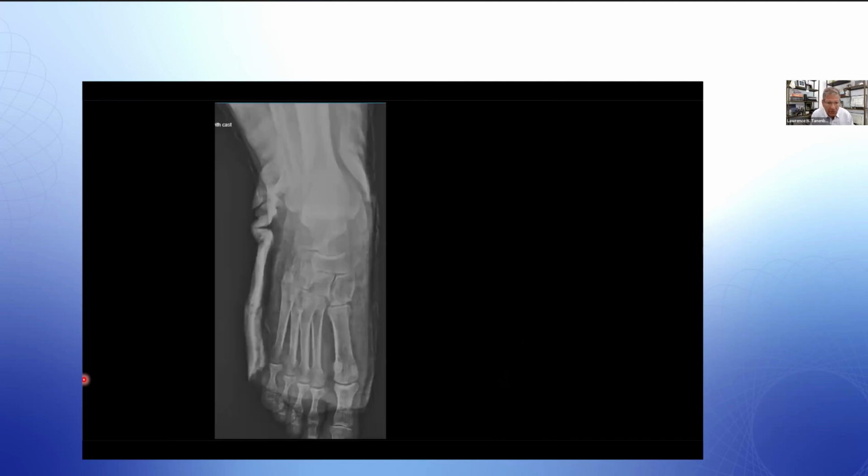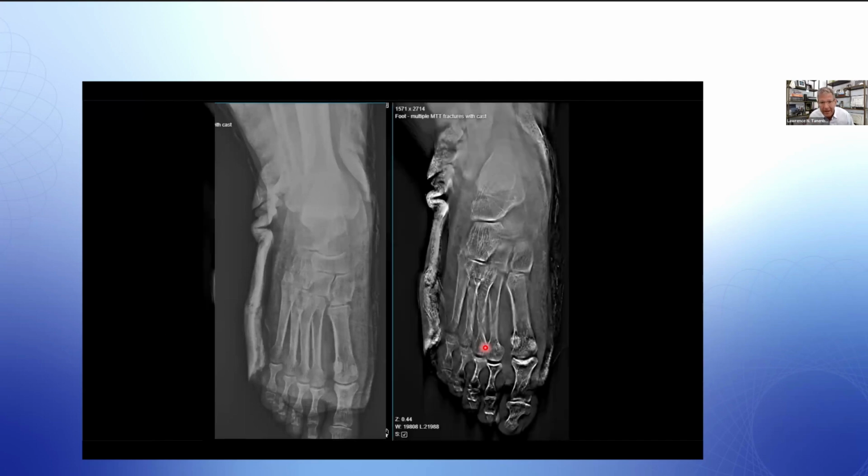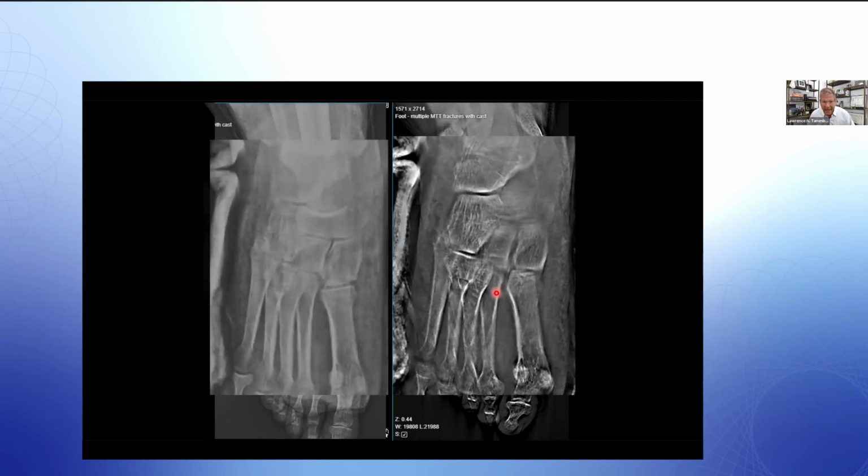Here you see a patient, again, who's in a splint of a sort, suspected fracture of the foot. I can't see much of anything on the full volume X-ray exam, but when we look at these tomosynthetic slices, you can clearly appreciate the fracture of the fourth metatarsal base, and just beautifully seen, even though the cast or splint is in place here.